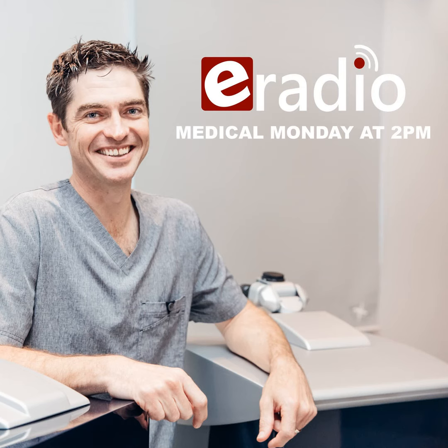So yeah, there's been improvements in tracking capabilities of the lasers as well. As I said, you can track in all the dimensions and your rotational capability as well. And if you've got a large amount of what's called astigmatism, which is that rugby ball shape of the eye, then it's really important that the machine is tracking you to make sure that it delivers the pulses on the exact axis of your eye to take care of all that astigmatism. Because if it couldn't track you, if it couldn't know exactly what the position of your eye was, then it's going to potentially deliver those pulses off center, so to speak, and not correct all your astigmatism or your short-sightedness or your far-sightedness.